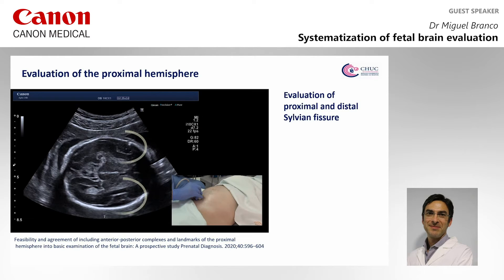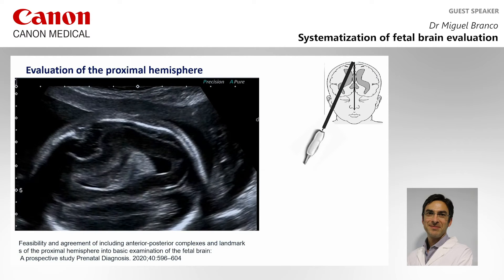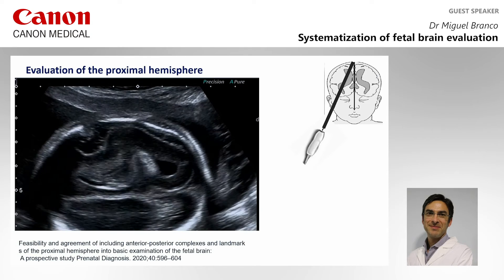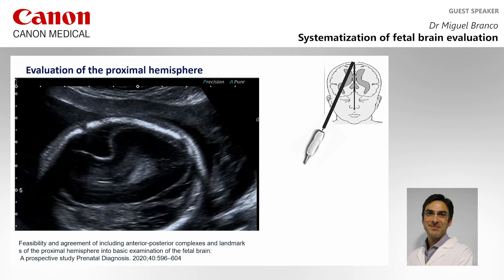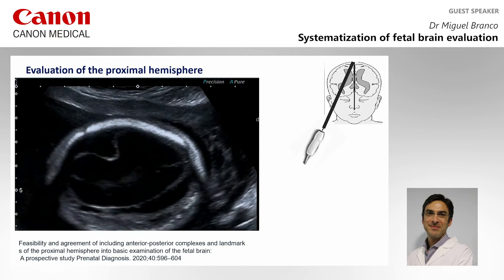The sylvian fissure opercularization is closely related with gestational age and is a useful tool for screening pathology of cortical malformation. If we tilt the probe to the fetal shoulder, we can also evaluate the proximal parenchyma and ventricular wall.